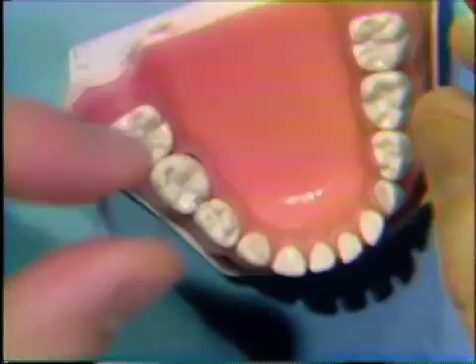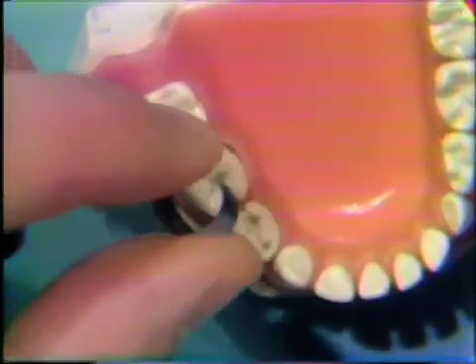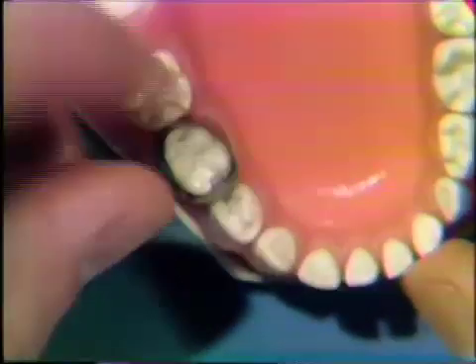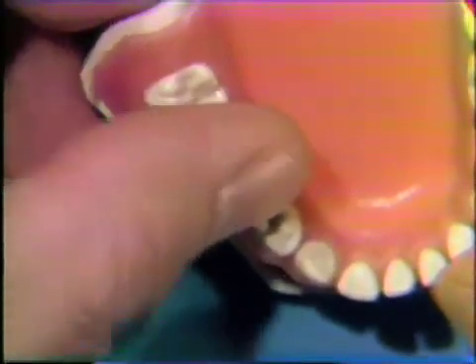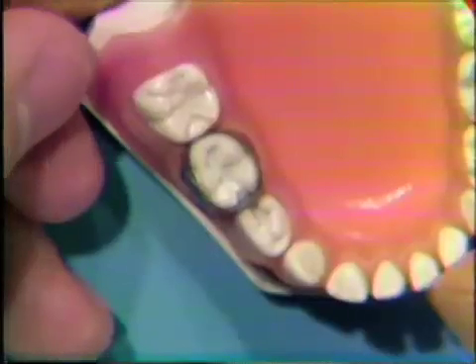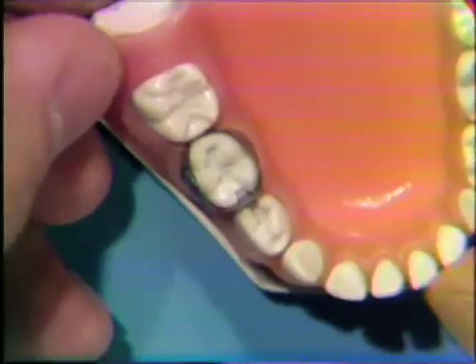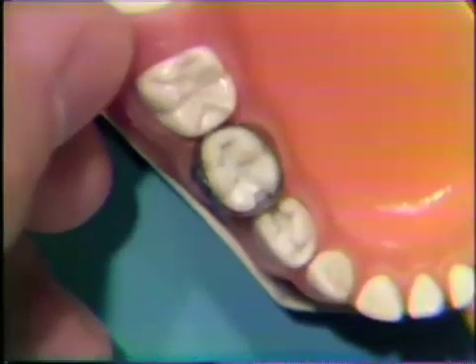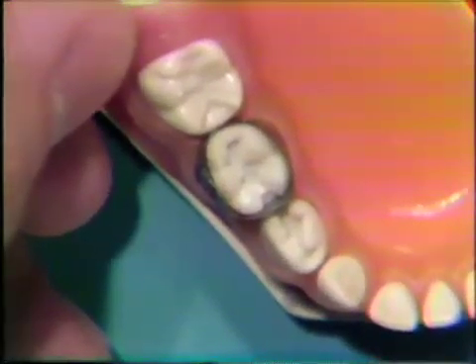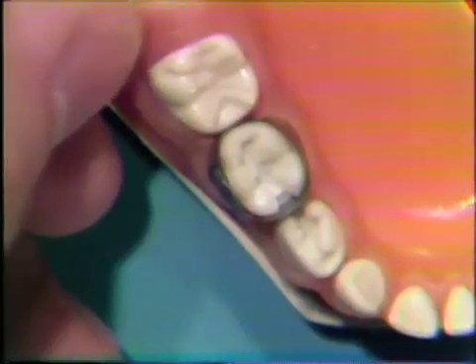Now the band is ready to be applied on the tooth. The band simply needs to be seated on the tooth — it should not be too loose or too tight. If the band is too loose from the time we crimp the band initially, the weld is not made tight enough. If the band is too tight when you seat it, the weld has been made too tightly, and the band should be remade, as a band which is too tight will cause the proximal surface to be under-contoured.